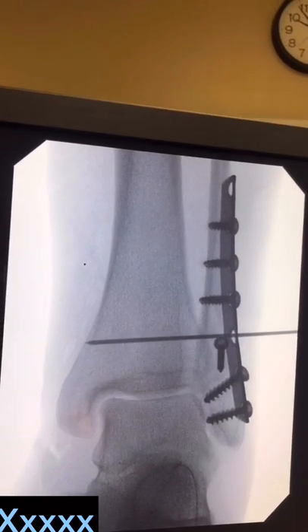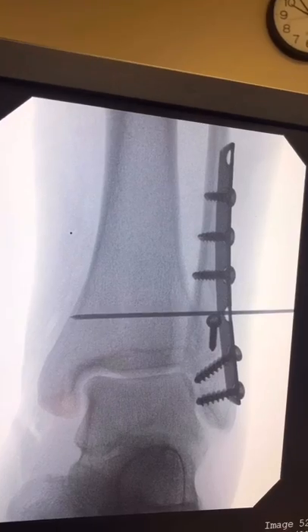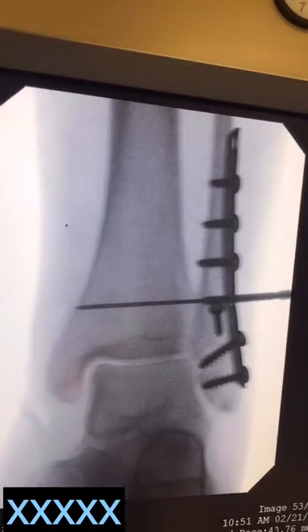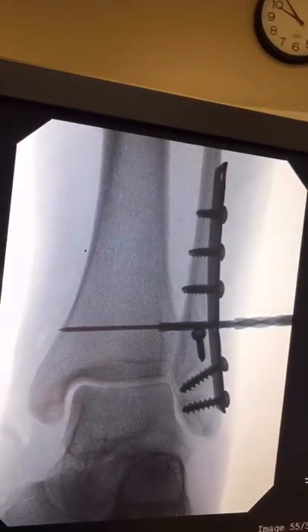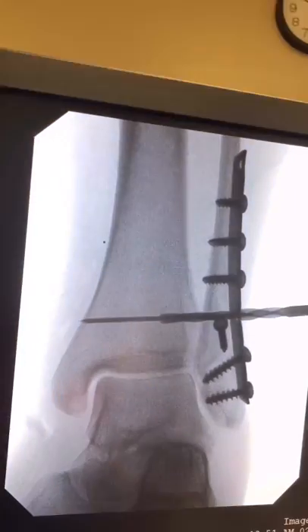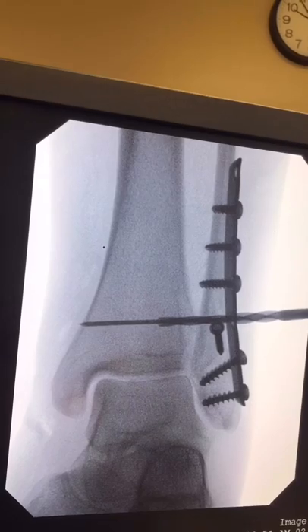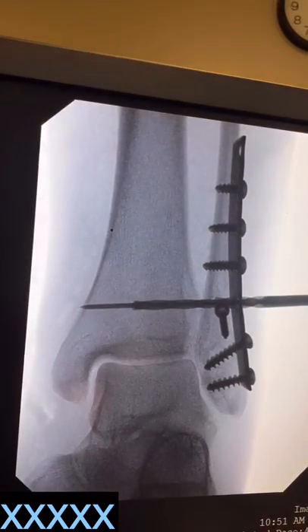Here you can see a fluoroscopic image of the tibia and fibula being drilled with the step drill. The smaller drill drills both the fibula and tibia, whereas the larger diameter portion of the drill only goes through the fibula, which is very important. This is easily confirmed with fluoroscopy.